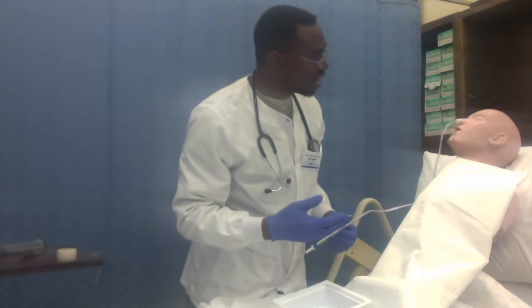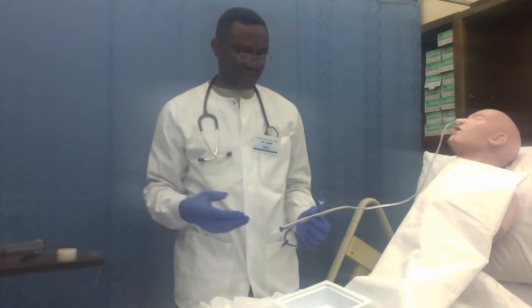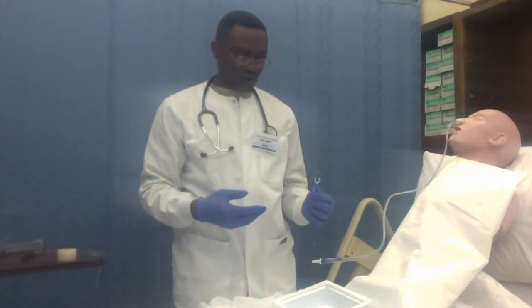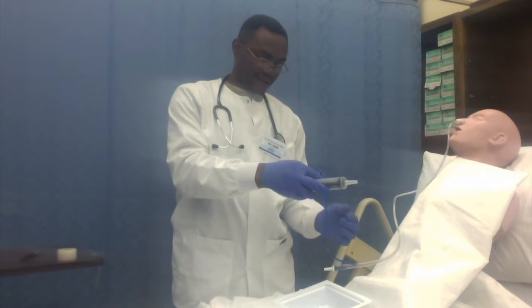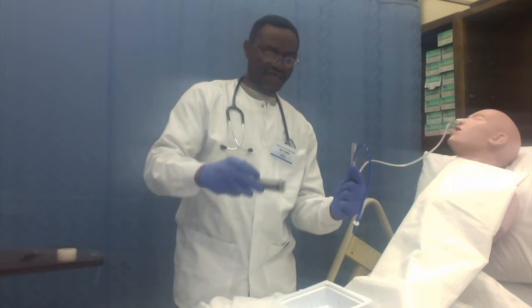Having secured my tube in place, I will assess the procedure to be sure that my patient is not having any respiratory distress. Then I will proceed to inspect the placement of the tube. I will do this by assessing to find out if he has any respiratory distress, or by getting an aspirate from the stomach content to find out the pH level of it.